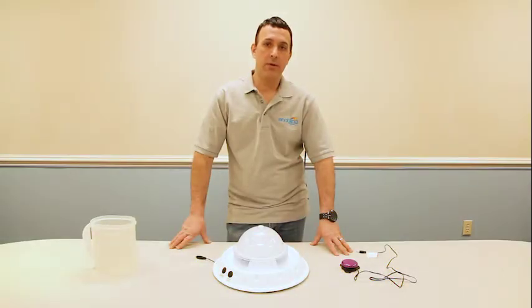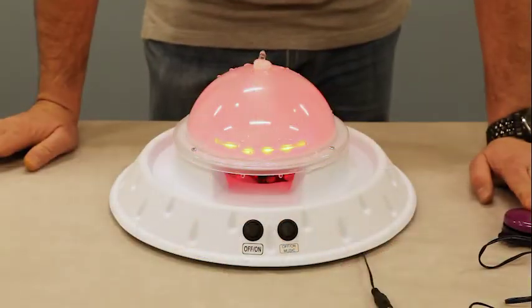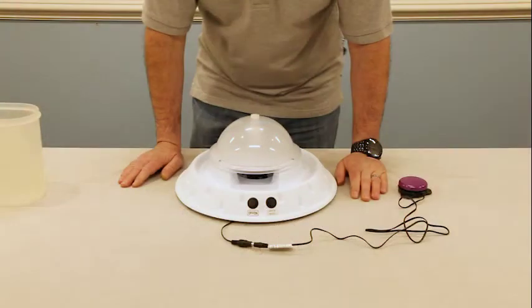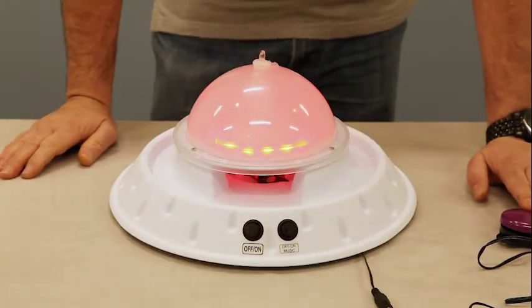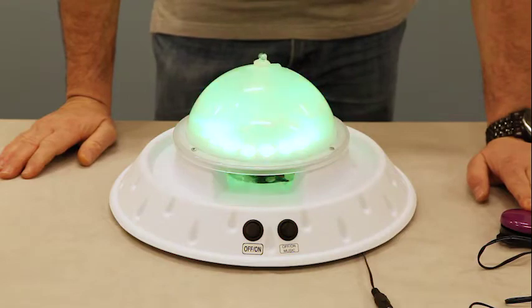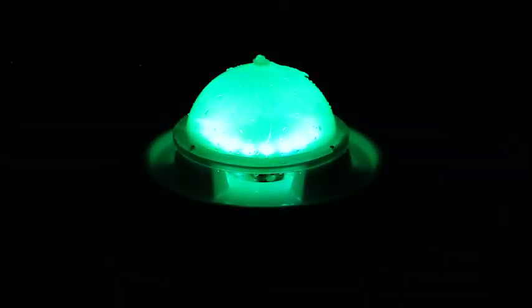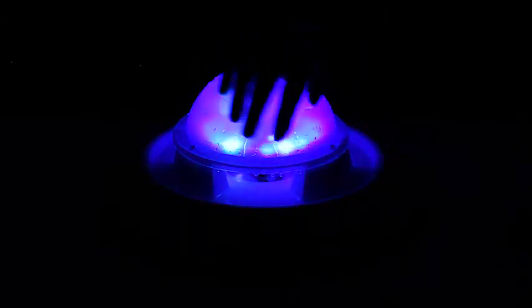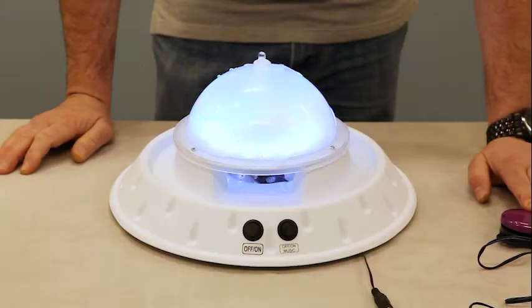Hi, Vinny Levorty here, technology specialist at Enabling Devices. Today I'd like to show you one of our products, the Aqua Dome, number 1691. I'm going to give you a quick demonstration to show you how it works.